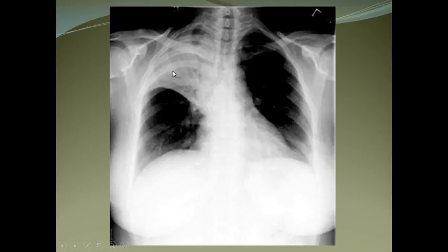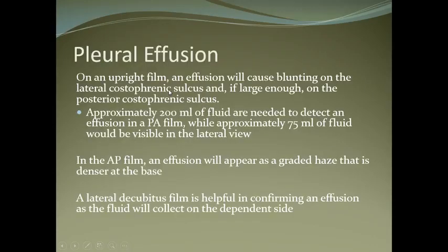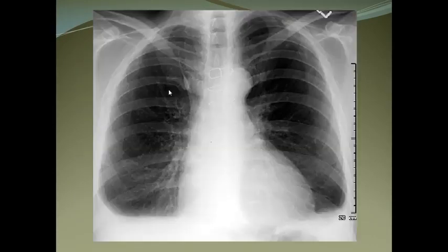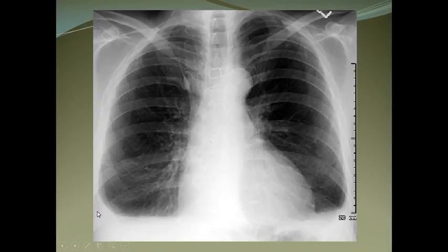Pneumonias appear as air-space opacities, lobar consolidation, or interstitial opacities. They can be seen with air bronchograms. In collapse, the opposite lung tries to compensate and becomes hyperinflated.